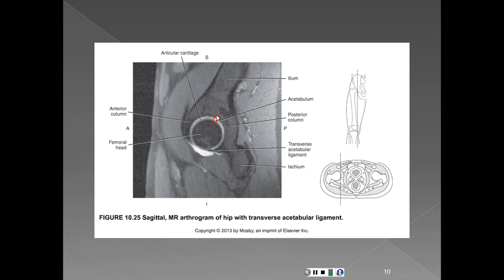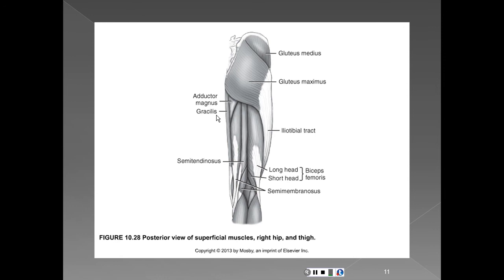So the vastus lateralis muscle is one of the quadriceps of the leg. The quads are in front, the hamstrings are in back. Okay, so the vastus lateralis is part of the quadriceps. We'll definitely look at the vastus lateralis muscle. And actually, a good picture of the bursa is figure 1027 on 667 at the bottom. And the bursa is a cushion. Remember that bursa is a cushion.